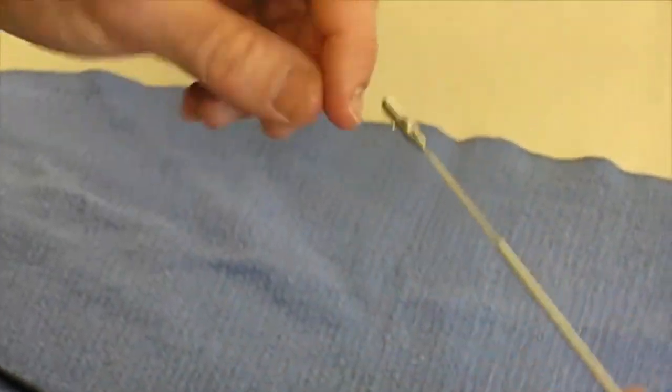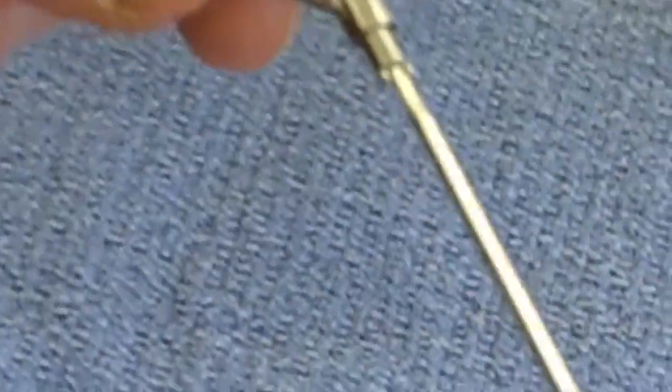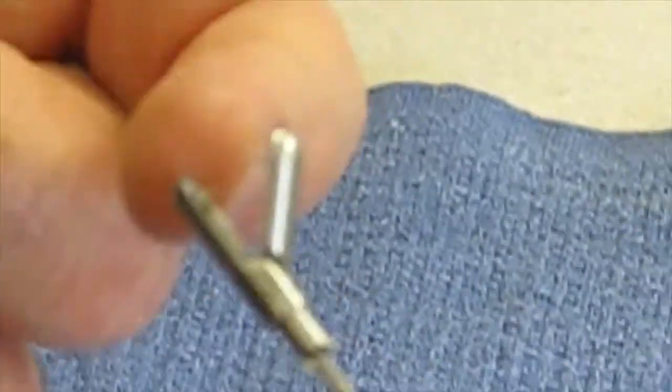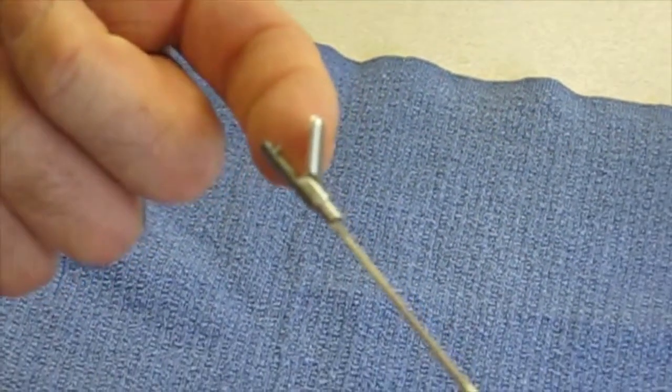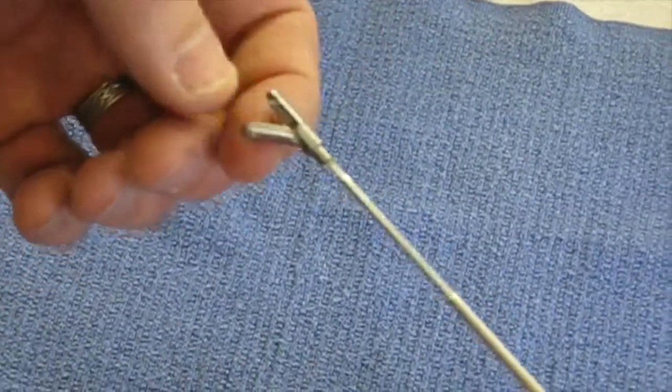A really important place to work on to try and clean is the hinges of the jaws, and the enzymatic cleaner does an excellent job of getting into those hinges. But I would also take a brush to this. We sell cleaning brushes, or a soft bristle toothbrush could also work pretty well.